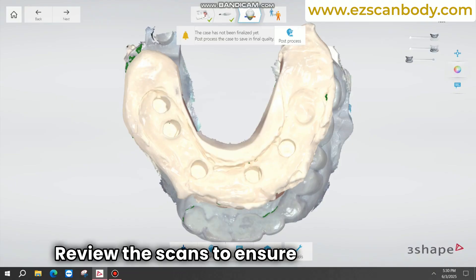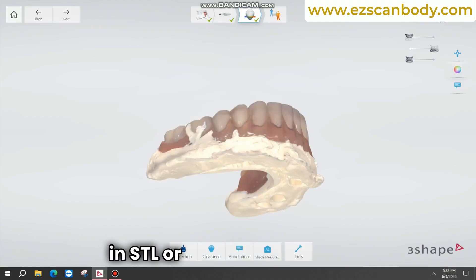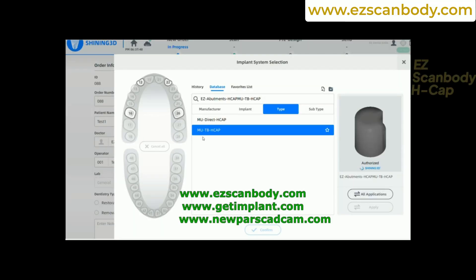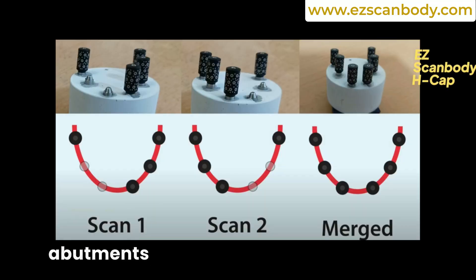Review the scans to ensure they are accurate and the bite is correct before exporting the files in STL or PLY format. The H-CAP serves as both a healing cap for multi-unit abutments and a scan body used to scan multi-unit abutments.